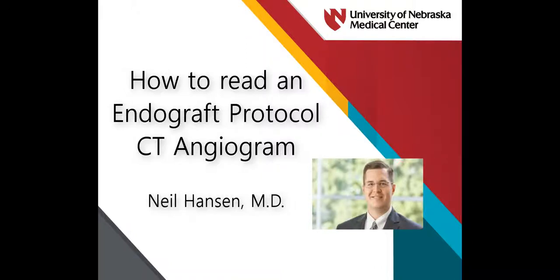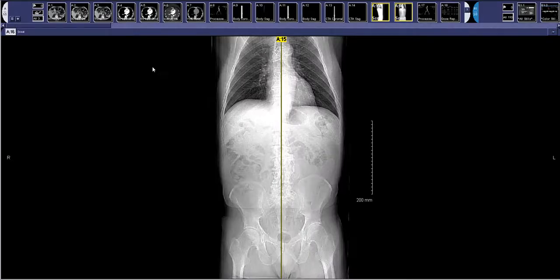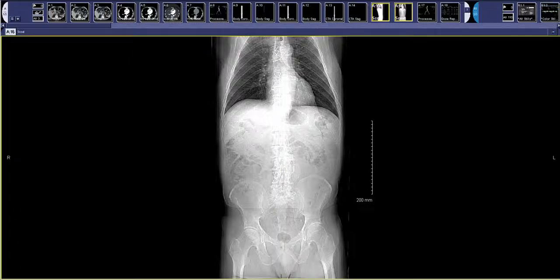Hello, this is Neil Hansen and I am taking you through an endograft protocol CT angiogram. Our endograft protocol is slightly different than your routine arterial phase study, and you should protocol a study for this whenever there's been a prior endovascular repair of an aortic aneurysm.